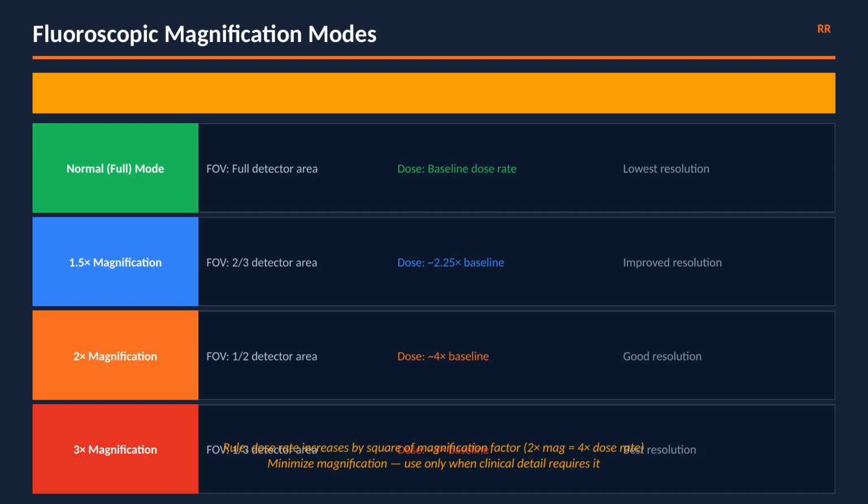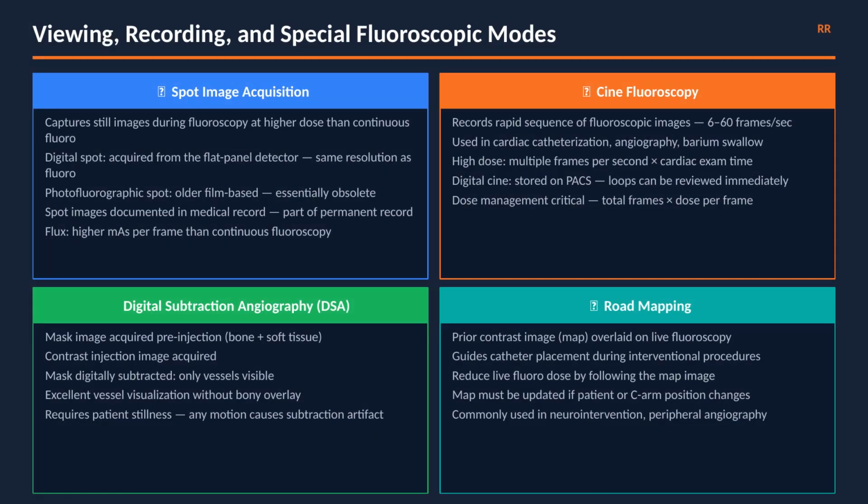Use magnification only when clinical detail specifically requires it. Return to normal mode the moment the detail work is complete. The dose impact compounds quickly, particularly in long interventional procedures. Four digital capabilities extend what fluoroscopy can do beyond real-time imaging.